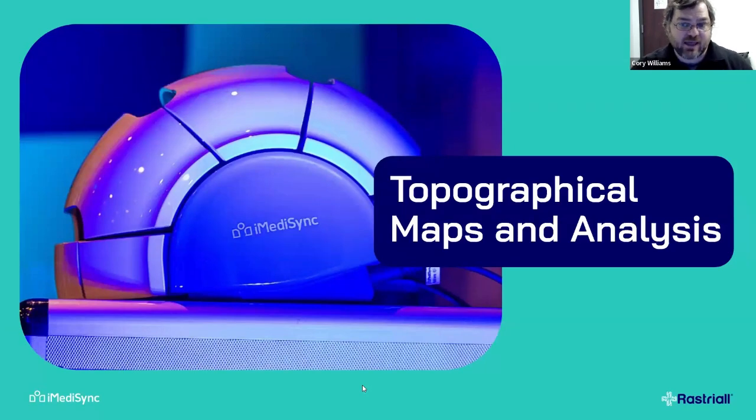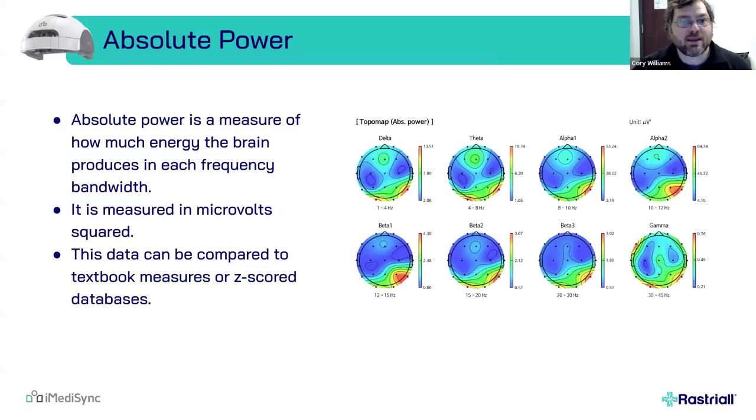Then, after we've done that, after we've got that raw inspection of data, we create maps. And these maps will show us where activity is the highest. So absolute power, which is what we see here, measures how much energy the brain is producing in a given bandwidth in a given sensor location.